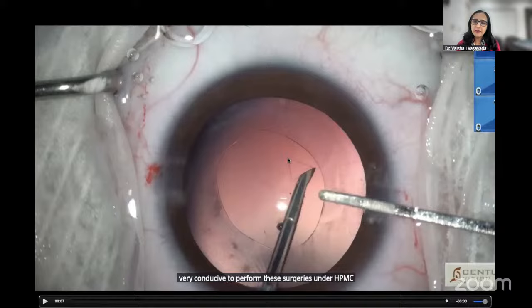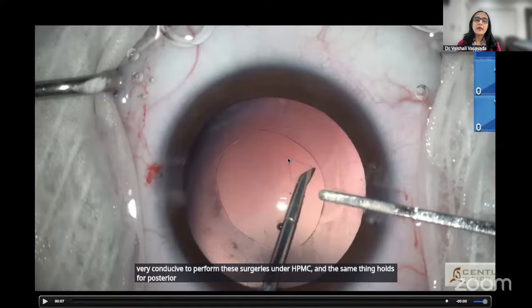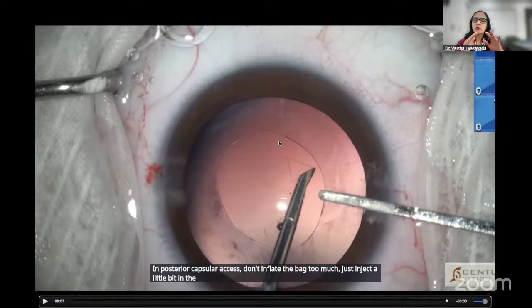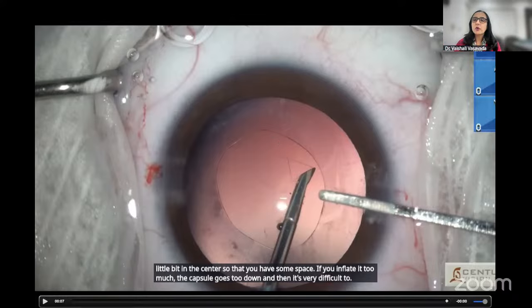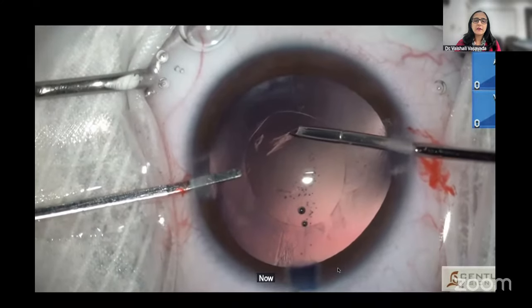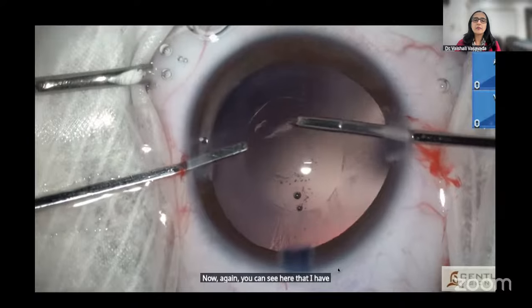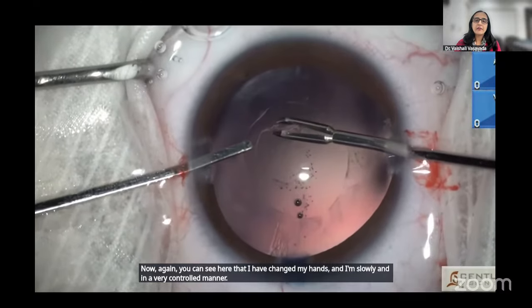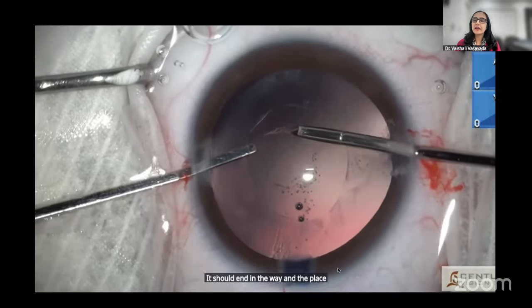And the same thing holds for posterior capsular rhexis. In posterior capsular rhexis, don't inflate the bag too much. Just inject a little bit in the center so that you have some space. If you inflate it too much, the capsule goes too down and then it's very difficult to manipulate, plus you are more likely to rupture the anterior vitreous. Now again, you can see here that I have changed my hands and I'm slowly and in a very controlled manner. It should end in the way and the place and size that I want to.